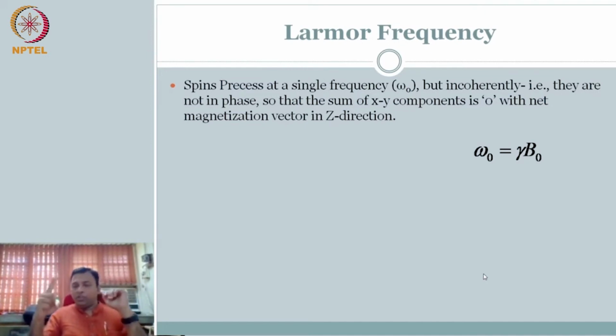Even though all of you are at the same angle in this up direction, you will notice with respect to the vertical that some would have stopped here, some here, some there. The angle of inclination is the same, because you are all hydrogen and you have the resting state that you have achieved at equilibrium. But when I say stop, even though you're doing this, you might be at different positions, right?